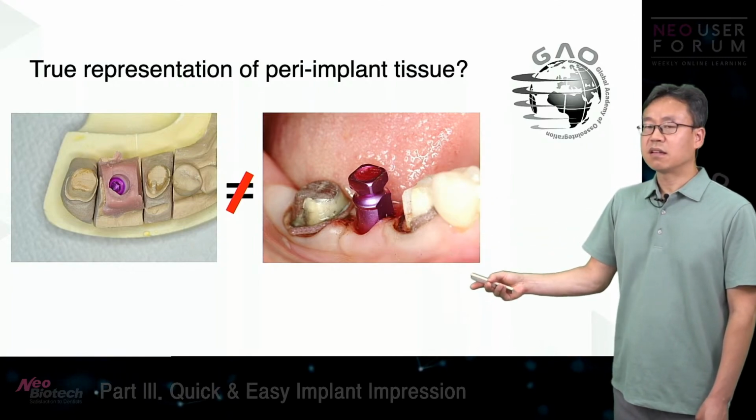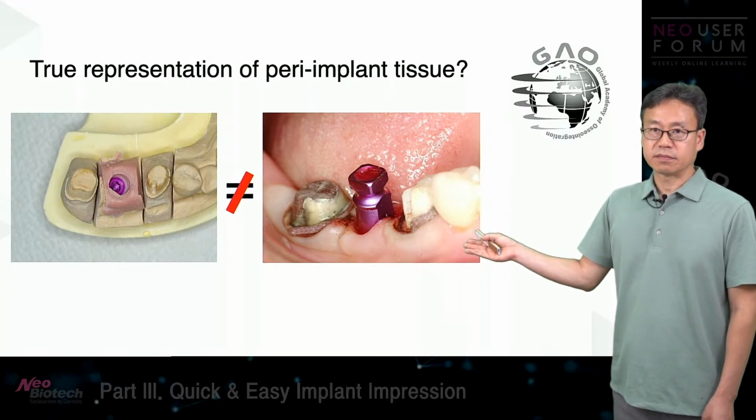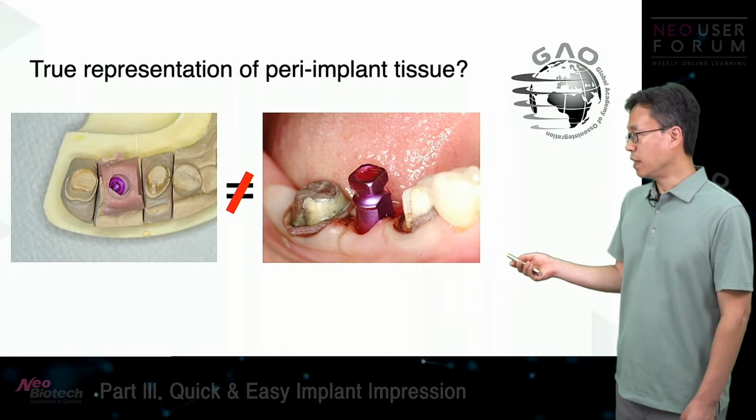This is not what the soft tissue actually looks like. So we don't want to be fooled by that.